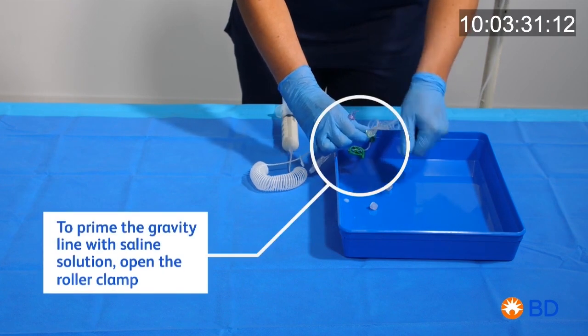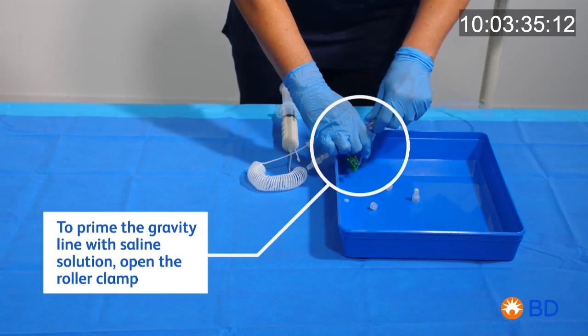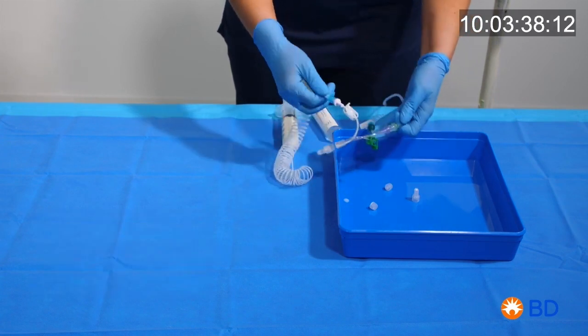Prime the gravity line with saline solution. At the end of the process, leave the IV set on a sterile surface. Make sure all the clamps are closed.